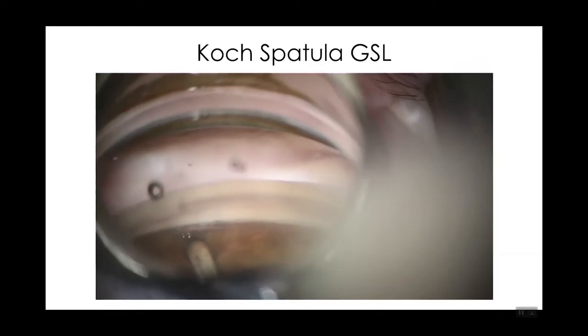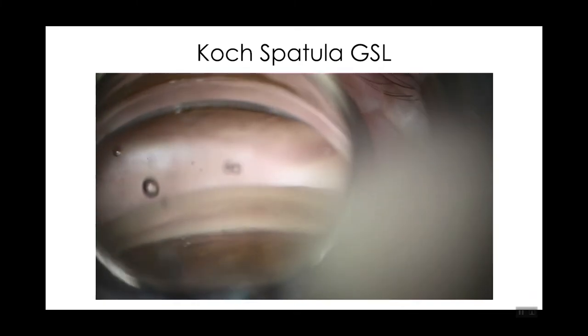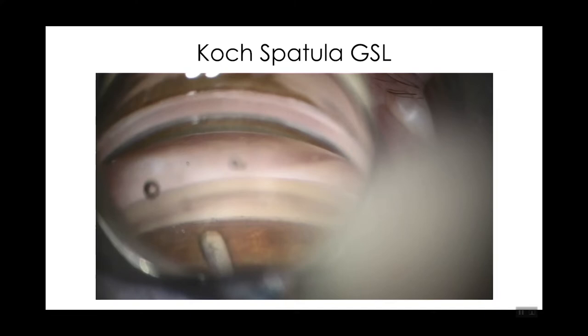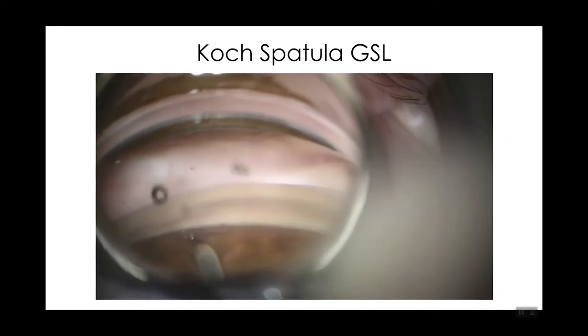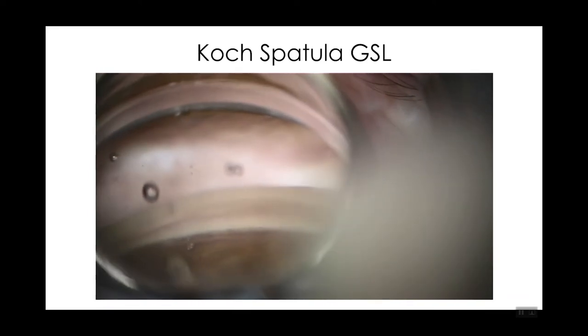This is a case showing a technique with a Koch spatula. After deepening the angle with a cohesive viscoelastic, the spatula goes into the nasal angle through the clear corneal incision, and the periphery of the iris is padded down away from the trabecular meshwork. This is a common technique used by many surgeons and can be quite effective at separating the PAS.